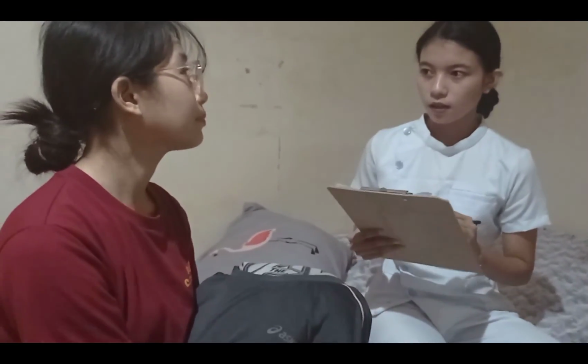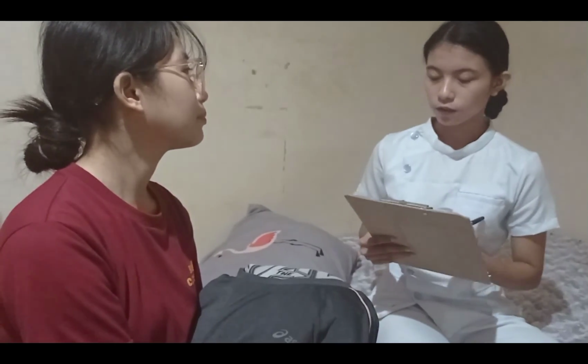The last step is to evaluate the patient's response to the injection within the appropriate time frame. Ma'am, if there are any adverse effects after this vaccine, please do see me.